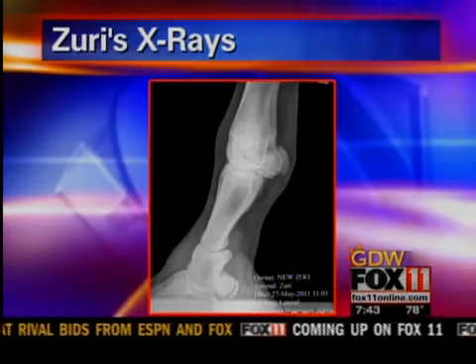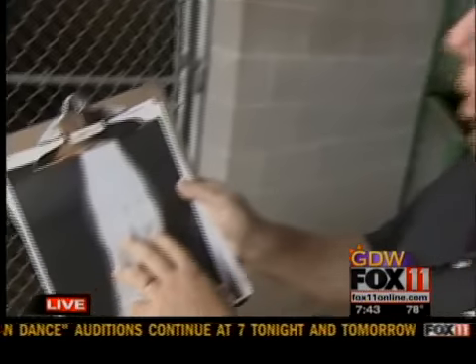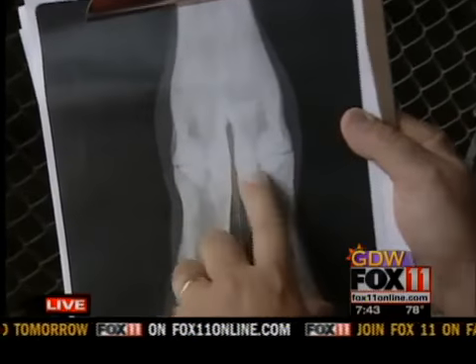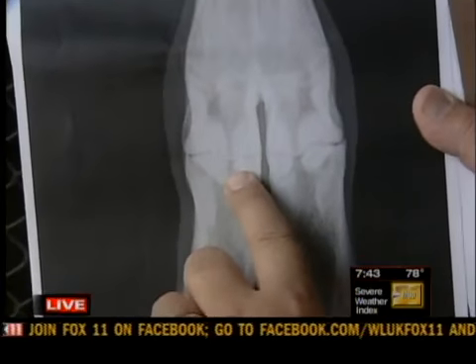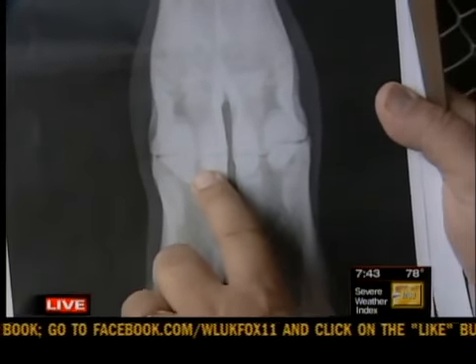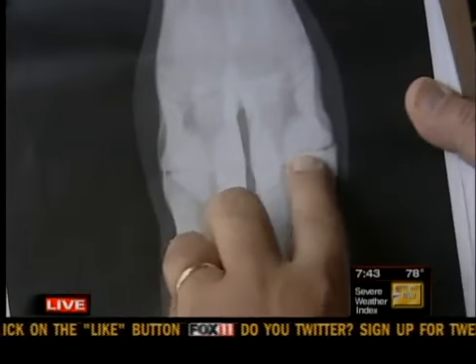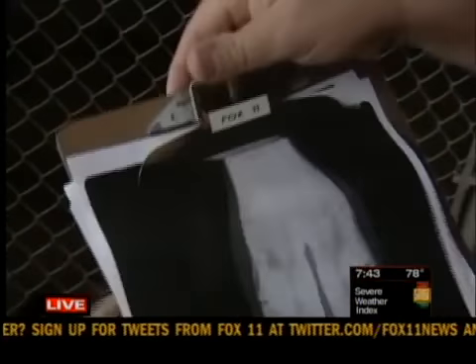Well, what we found is, I'm going to show you this. I've got a picture of this with me, just so you can see as you were looking at the images. Now, there's these little bones. This is the right leg. And see these 4 little bones here? Mm-hmm. Okay, those are sesamoid bones. We have these. Okay. And what they are is to help stabilize the leg when you're running so it doesn't overflex. These are little bones. You've got 4 here and you've got 2 on the back side you can't see. This is her right leg.